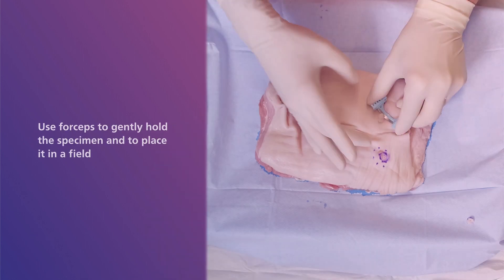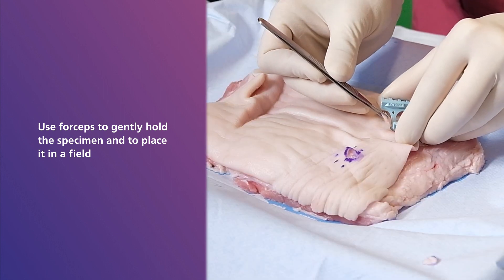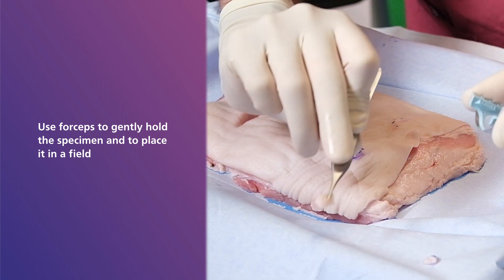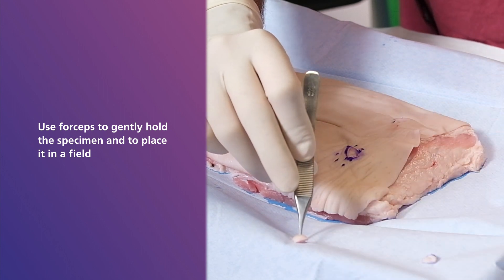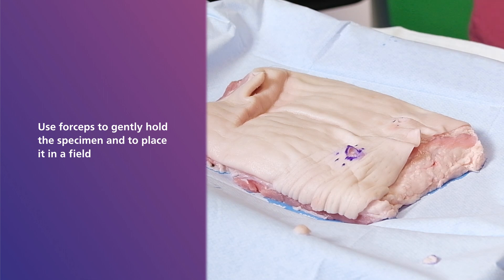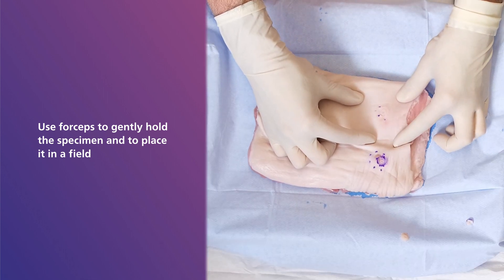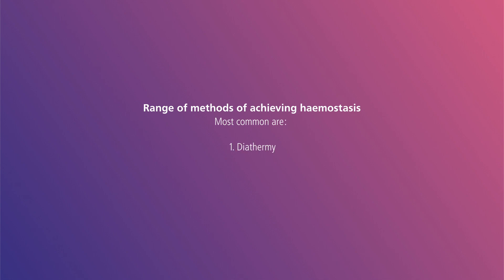Once the sample has come away from the skin, you can use forceps to gently hold the specimen and place it in a field. Shave biopsy sites heal with secondary intention after hemostasis and application of dressing. There are a range of methods of achieving hemostasis, the most common of which are diathermy or topical hemostatic agents.